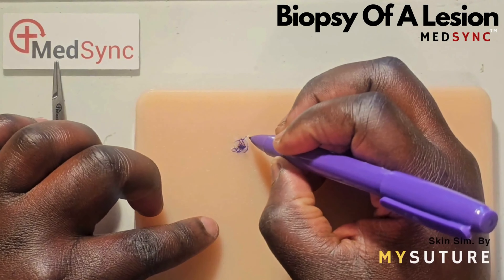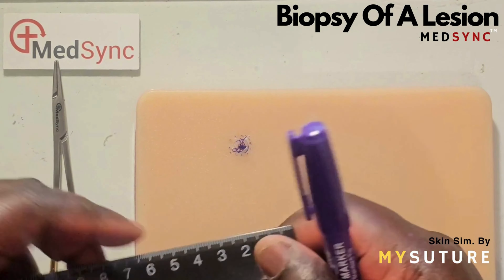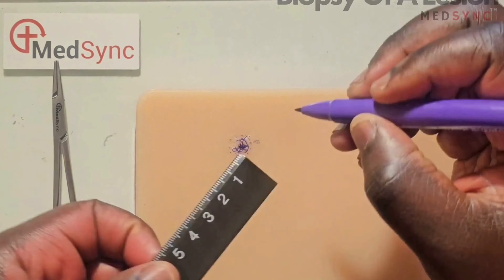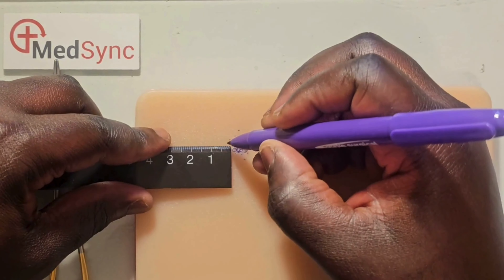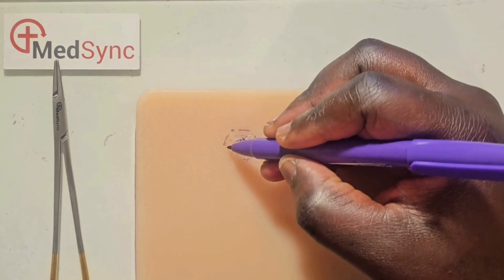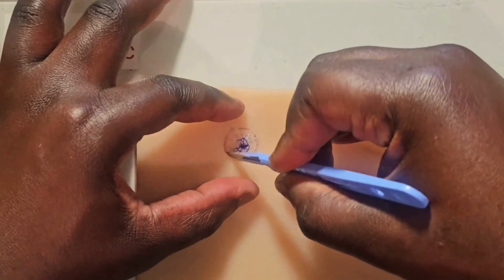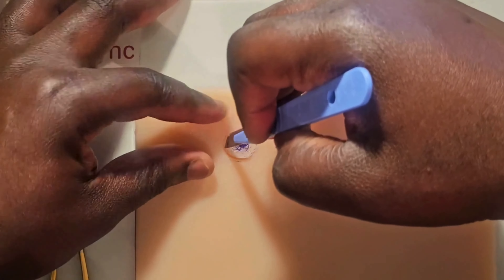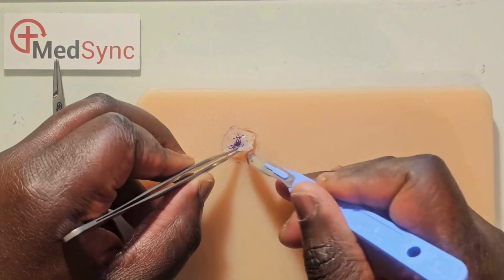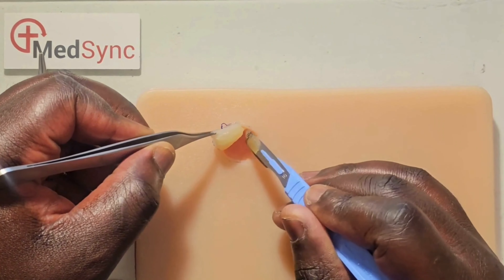Excision of a lesion commences with defining its margins. This can be done with small dots along the visible border under bright light; sometimes you will have to define the lesion palpably. A biopsy margin is 2 mm around the lesion, which can be marked with dashes. Excision commences inferiorly to ensure the blood runs out of the operative field and does not obscure your markings. You define the depth of the excision at one edge — for a biopsy, this is with a cuff of fat.